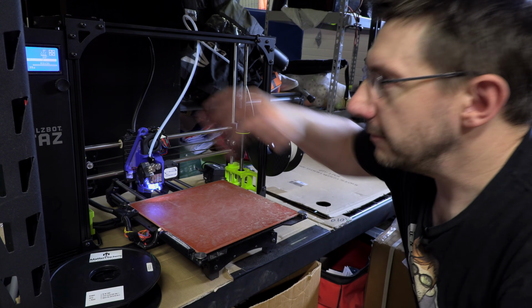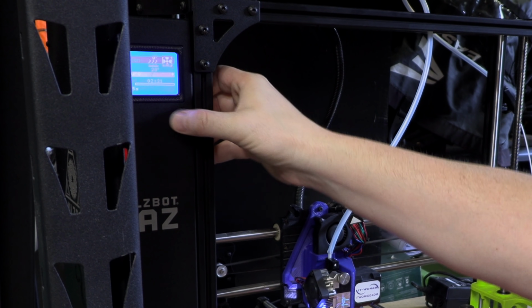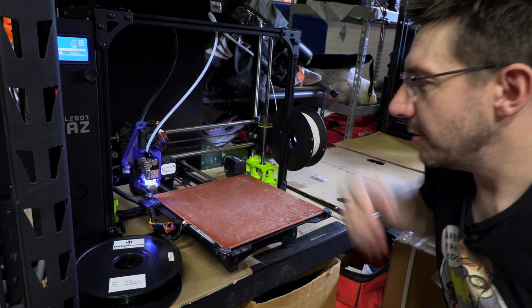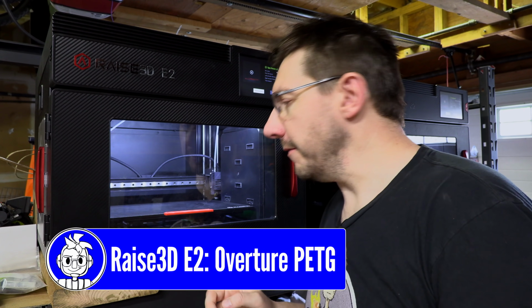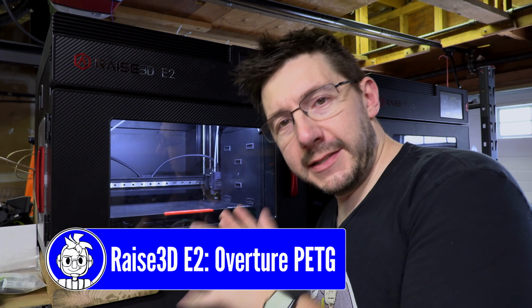So with that cleared off, up at this menu, can you see that? Yeah, you can. This menu, I click and go down to the bottom, print from SD, 1, 2, and print. So it goes over here and establishes Z, and then it levels, and then it starts printing. Next machine.